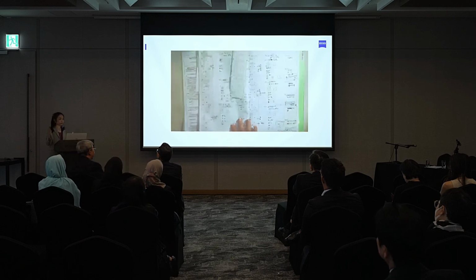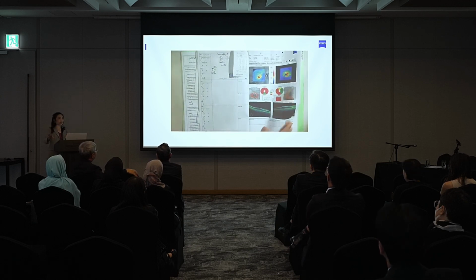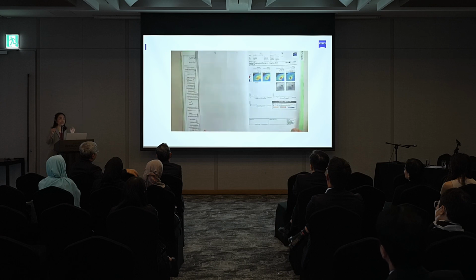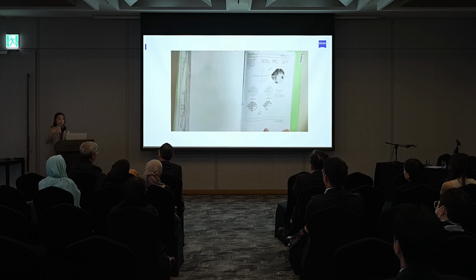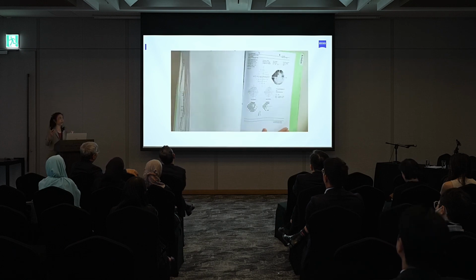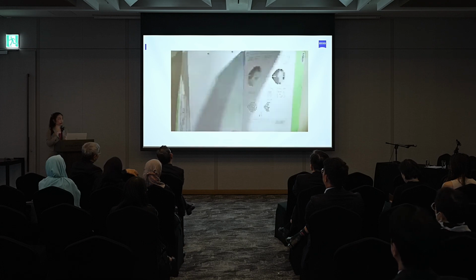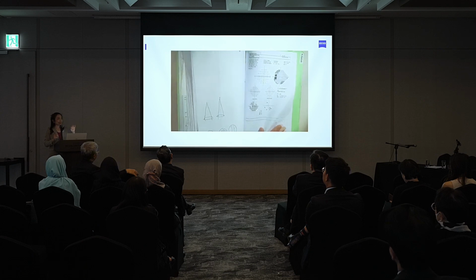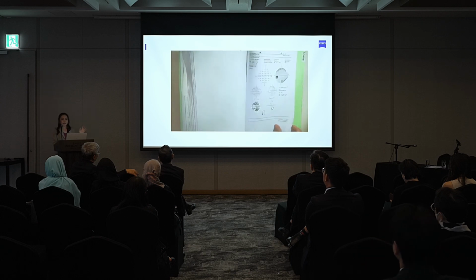Remember the visual field, right eye, left eye, 24-2, 10-2, and sometimes the date and month is slightly different in each, so you have to arrange them orderly and sequentially, and remember how it was, so you can compare them and see whether this is progression of glaucoma or not. Not to mention the reliability of that test. Lots of work that you have to do, right? I believe you can imagine this.